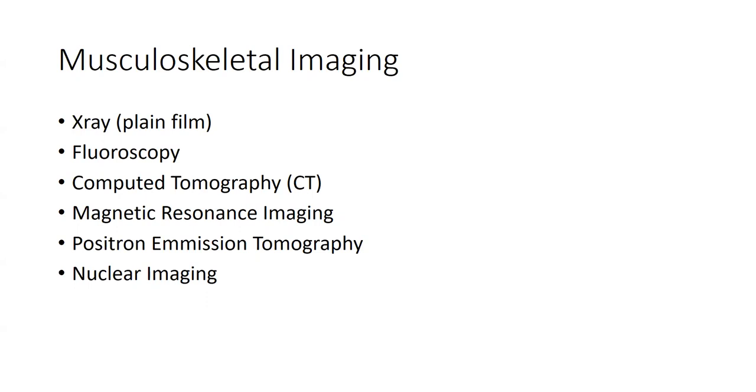This list is incomplete. When we talk about musculoskeletal imaging, there's a lot of different ways for us to look at the body. What's the most glaring omission here? Think about obstetrics more than ultrasound. Okay, we use ultrasound a lot in orthopedics. I use them to look at little kid hips.